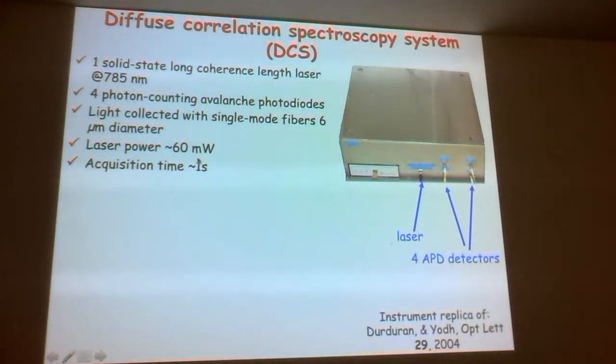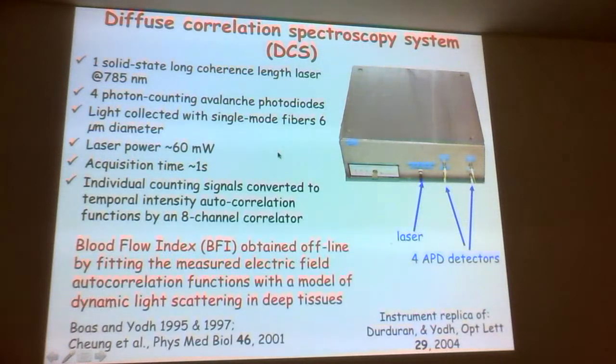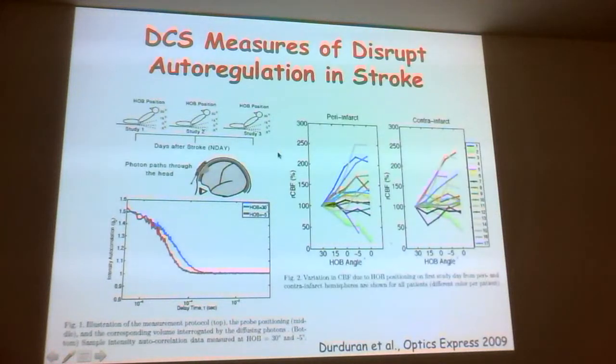So we now use more laser power because we have that single mode detector. We really push the limits of what we're allowed to do from the laser safety perspective. So it's 60 milliwatts we like to use for this measurement. Let me just skip some of this.